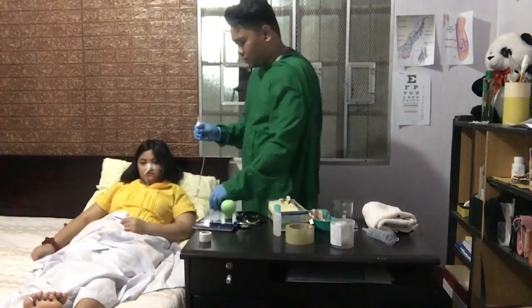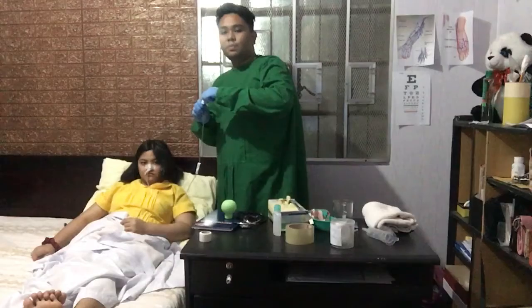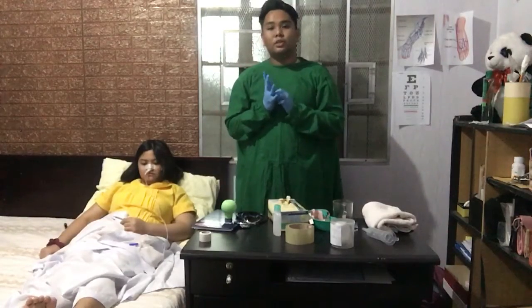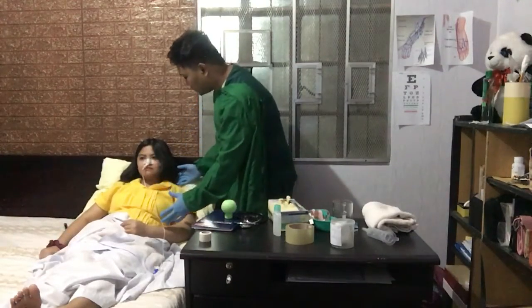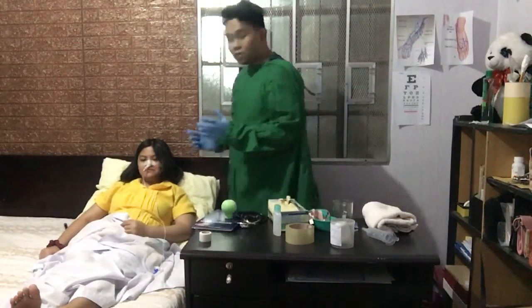Then, we cap it. Then, observe the patient response during and after the tube feeding, and assess the abdomen at least once a shift. Then, have the patient remain in an upright position for at least 1 hour after feeding, so that the nutrients go to the stomach more quickly and accurately.